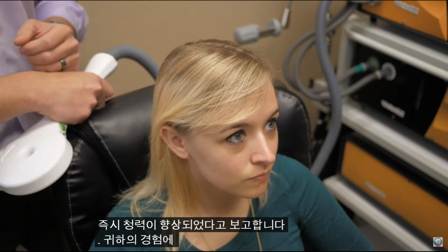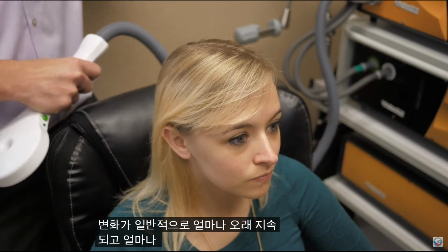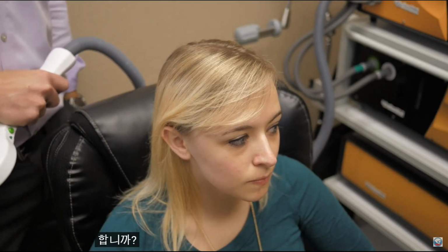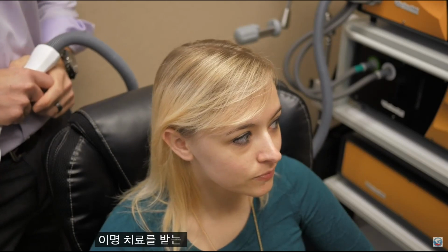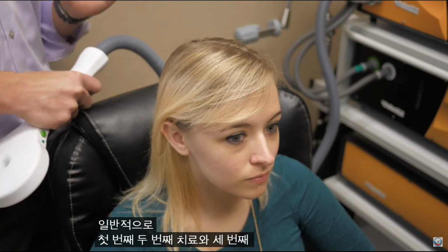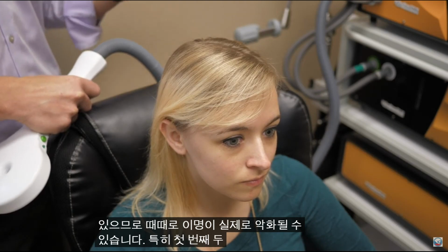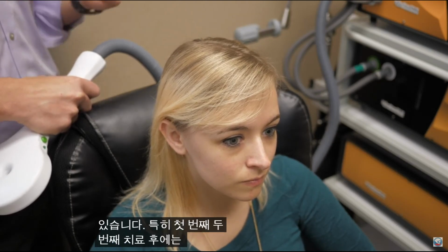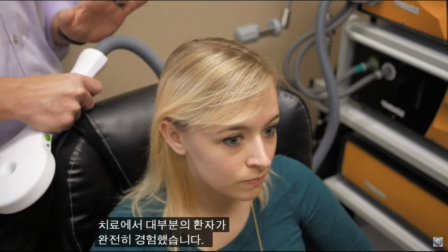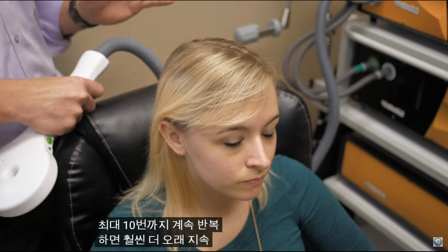And in your experience, how long does this treatment typically last, and how severe do the symptoms start out, and what do you usually bring them down to at 1 to 10? So for most patients receiving the tinnitus treatments, we will typically see a fluctuation between the first, second, and third treatment. So sometimes their tinnitus may actually worsen, especially after the first to second treatment. They'll notice vast fluctuations, but typically by the fourth treatment, most patients have had completely resolved symptoms. And then you continue to repeat them up to 10 times, it produces a much more lasting effect.